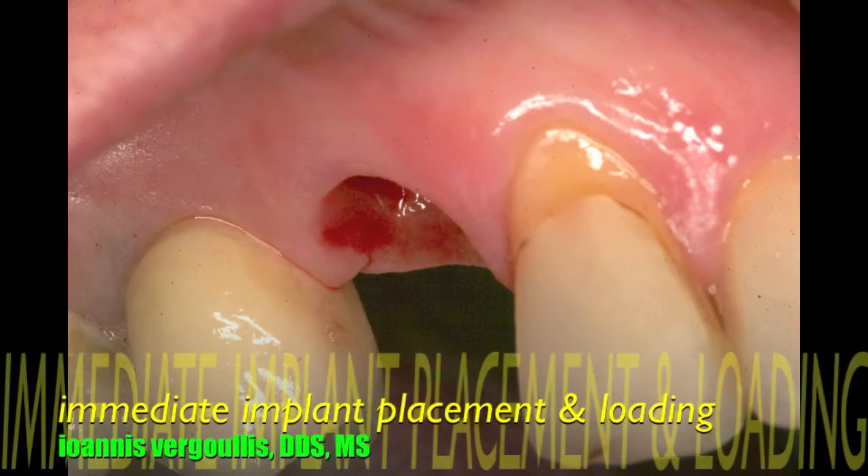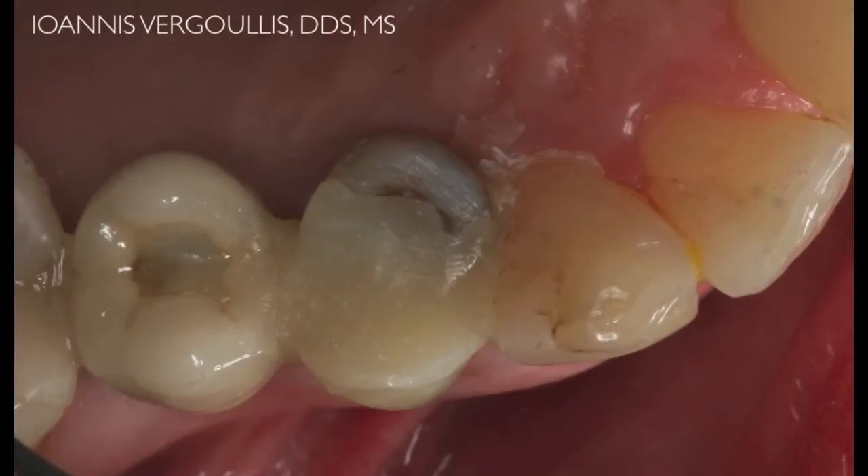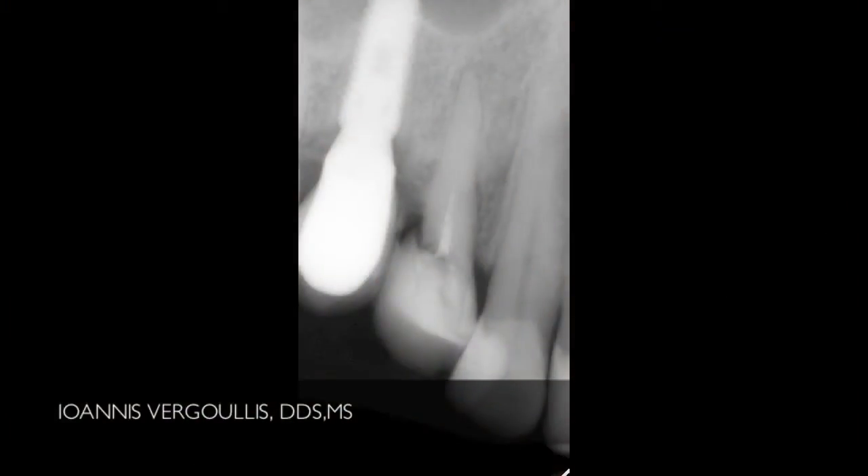In this case, we will describe the technique of immediate implant placement and loading. Number 14 has been deemed hopeless for restorative reasons, so we decided to remove the tooth and immediately place an implant. If primary stability is achieved, then we will immediately load the case.